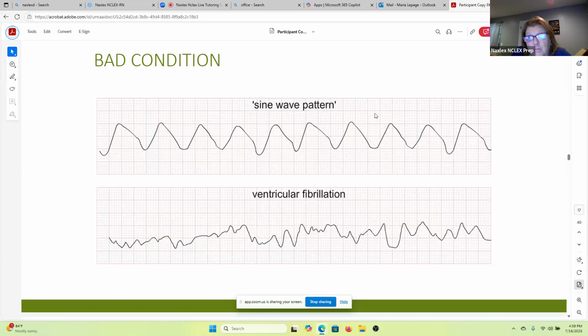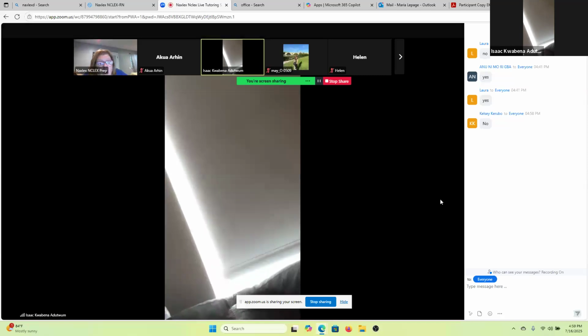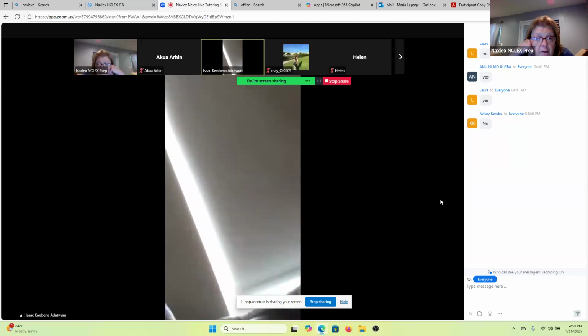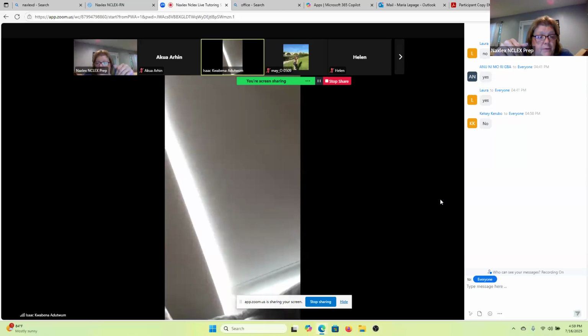So in VFib, we first do the CPR to get a pulse before we defibrillate, right? So, yes, you're going to start CPR immediately, but you also need to get that defibrillator. That patient needs the defibrillator, but while you're waiting on the defibrillator, you need to be getting that circulation going. So think about the reason why we teach the community and the layperson CPR, because most often when patients collapse and pass out due to a heart attack, they are in ventricular fibrillation. The end goal is we need to get defibrillation on this patient. However, there's not always a defibrillator right there, right? If you're at home, you don't have a defibrillator. So we teach lay people to do CPR.